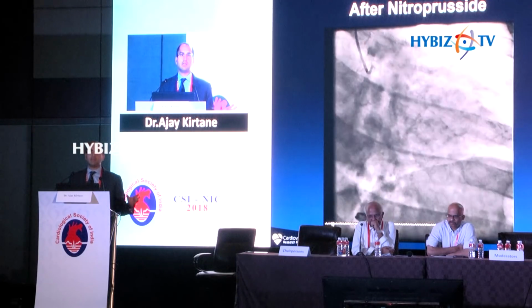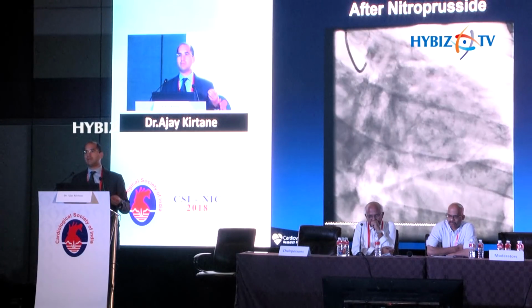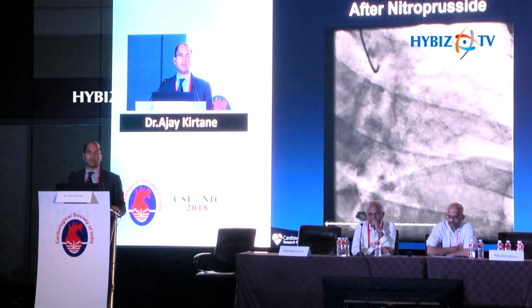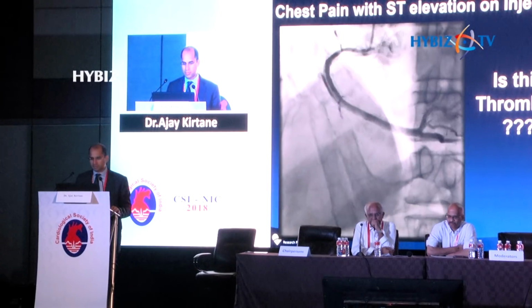So in this case, the interventional fellow should not be disappointed. He should actually be happy because he made a diagnosis in this particular case that the patient had microvascular dysfunction as the etiology of his or her symptoms. Here's another case. This was a case that was referred as a second opinion.